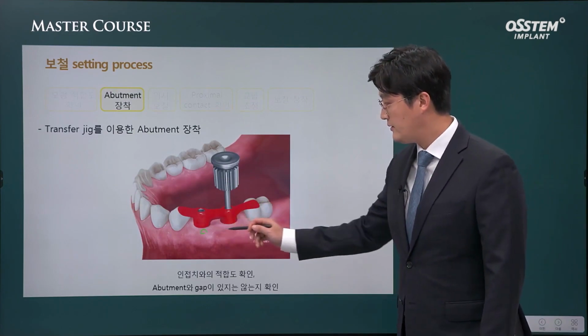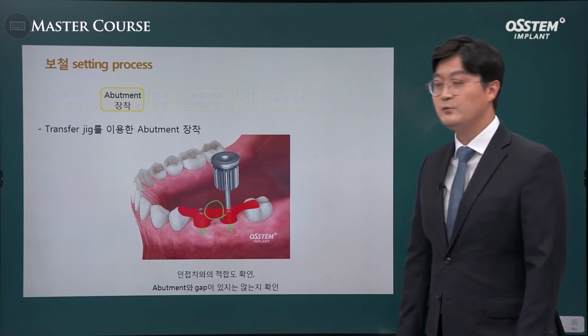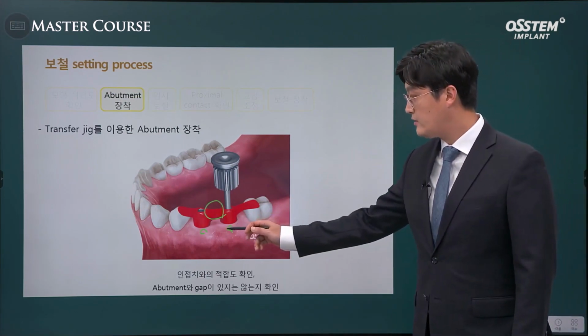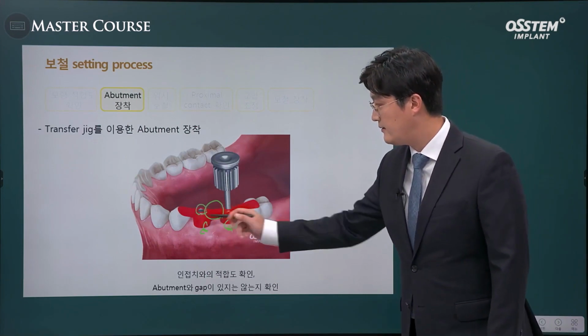This jig transfers the abutment to the oral cavity. You need to check whether this jig fits well. Be it custom or stock abutment, you need to make sure whether there's any gap between the abutment and the jig.